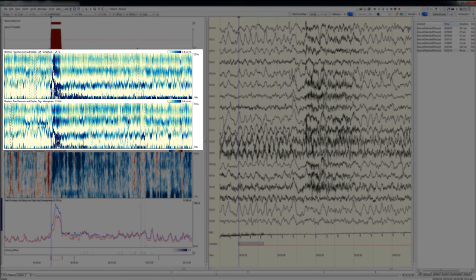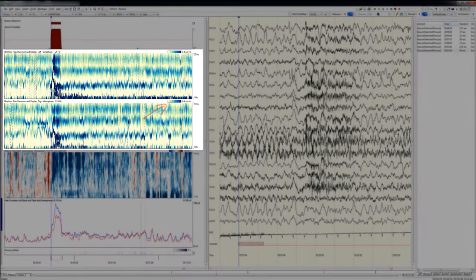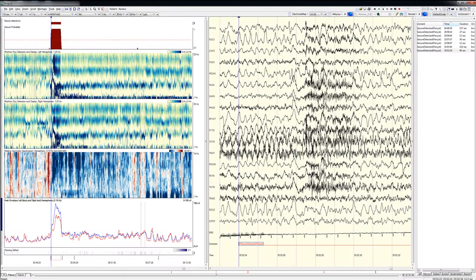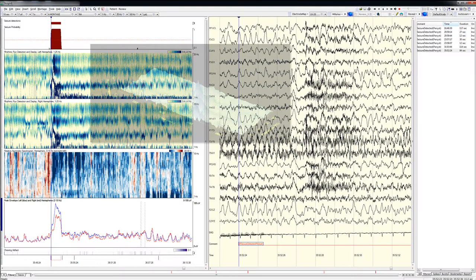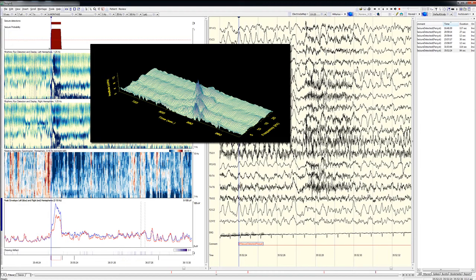The rhythmic run detection and display graphs are next. These depict the rhythmic activity in the left and right hemispheres, respectively. Increasing amplitude of rhythmicity at any particular frequency is represented by a color scale going from yellow to green-blue to blue. This is actually a three-axis graph in which the color scale represents the third axis. The inset image demonstrates the three-axis nature of this graph.